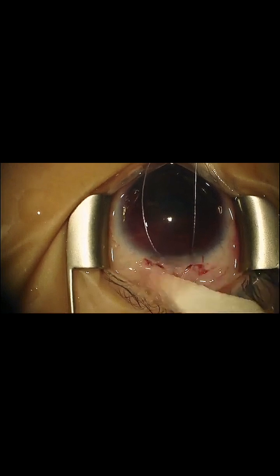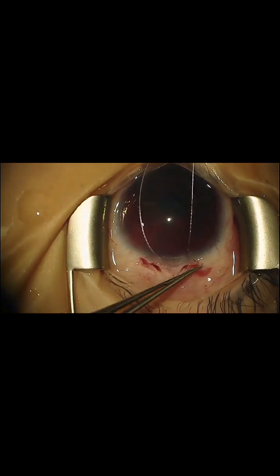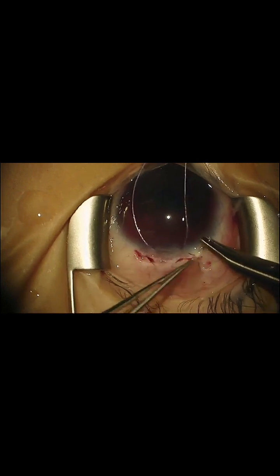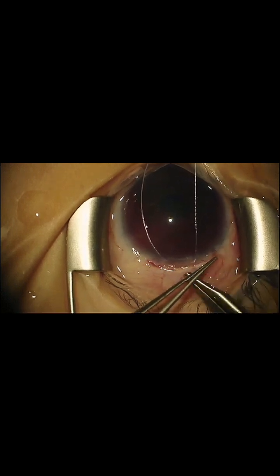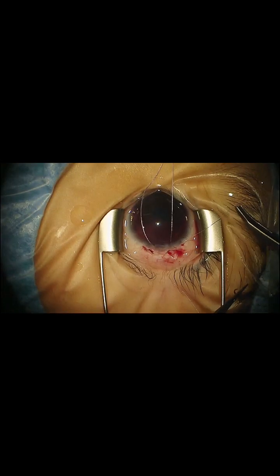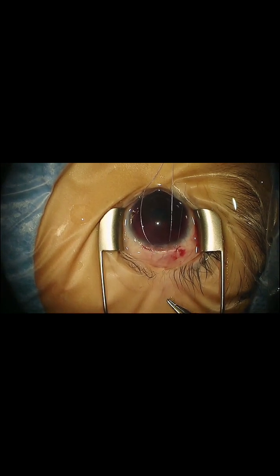Yeah, I think you could do either one, Nate. It's pretty much surgeon's choice when you have a cornea that's relatively clear like this. Okay. The reason I chose trabeculotomy is that if you're going to learn one technique that you can do on every patient, it's trabeculotomy. Because the underlying problem is a dysgenesis of the angle, you could do this surgery on anyone with congenital glaucoma. And the nice thing is that once you open the angle, if you get a favorable pressure result, it'll stay that way forever.